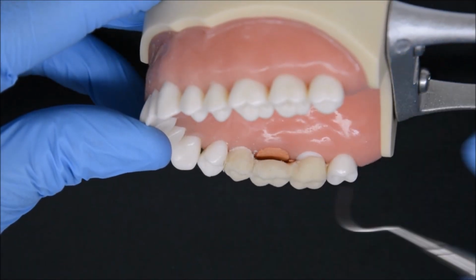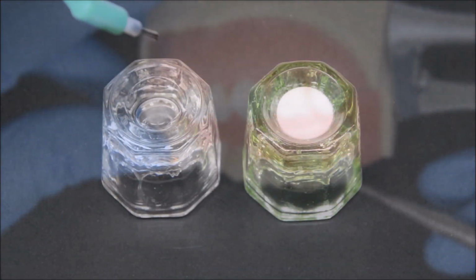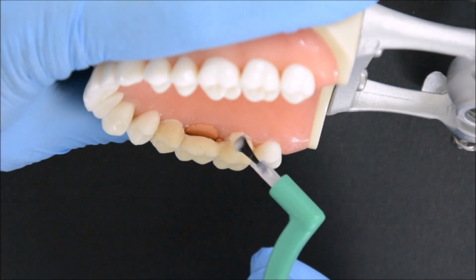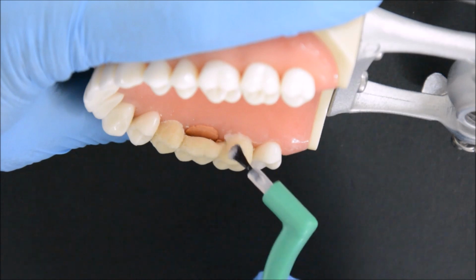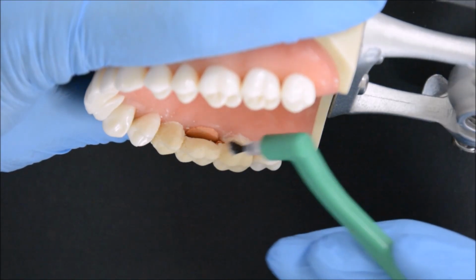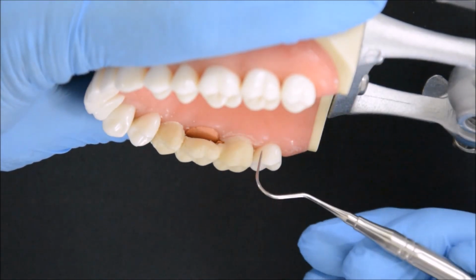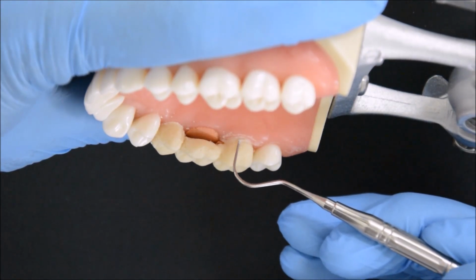Correction of any discrepancies can be done using the paint-on technique. Care must be taken not to apply too much material that may spread over the oral mucosa and irritate it. The excess is removed and the provisional is then finished and polished.